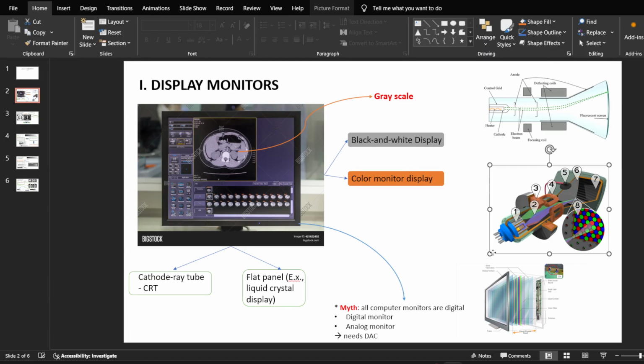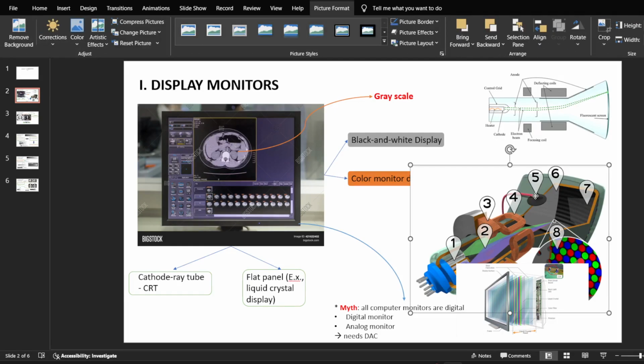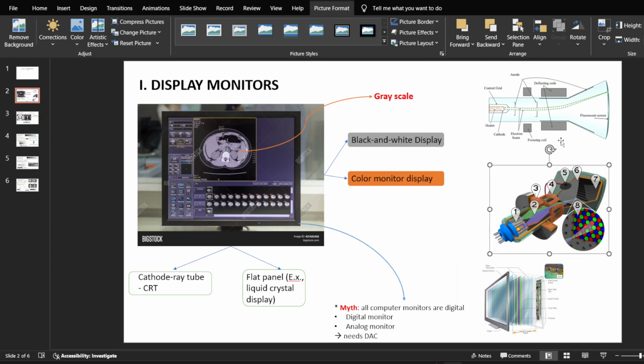This is it. Can you see it? Okay, oh my god, you will have color right here from the electron beam. So these two pictures are just some basic illustration of the CRT type of display screen. But the point is, my friend, in the modern world, in recent times, there are very few CRTs.